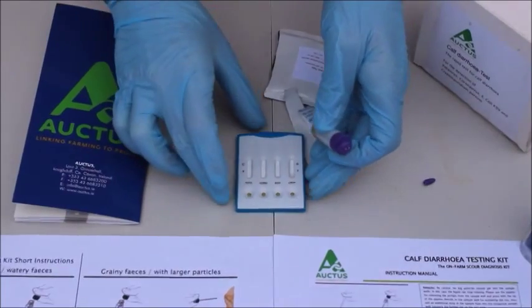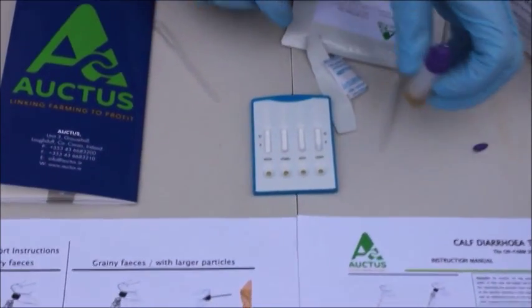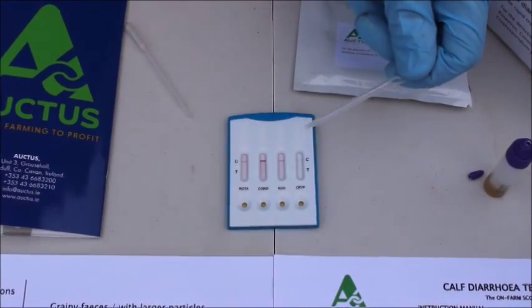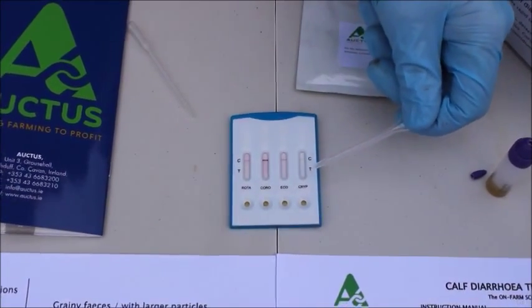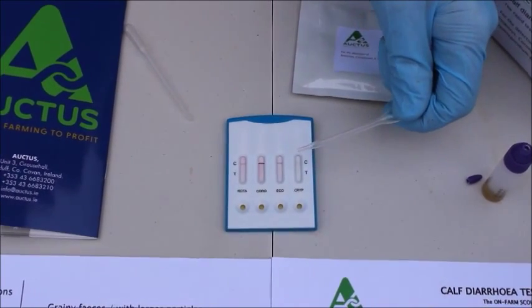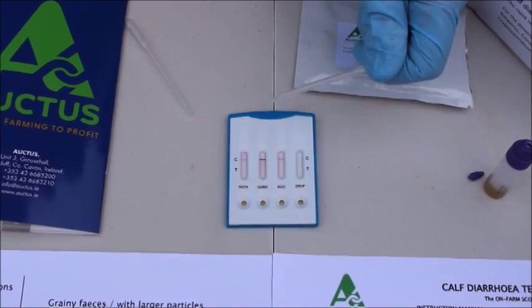As you can see on the sample, the solution works its way up the cassette. Once the solution has worked its way up the test cassette, it takes between five and ten minutes before we can make an accurate reading.